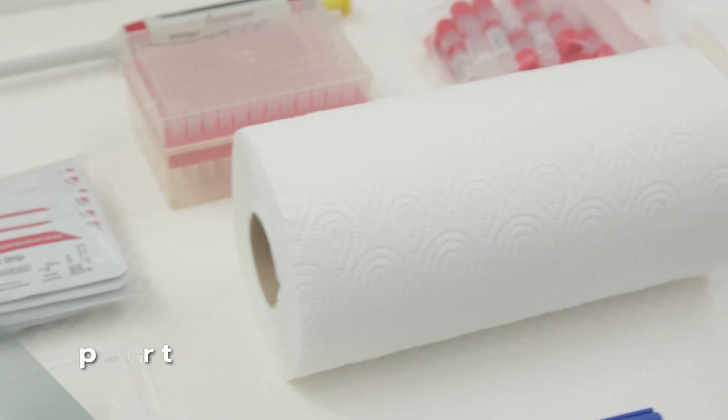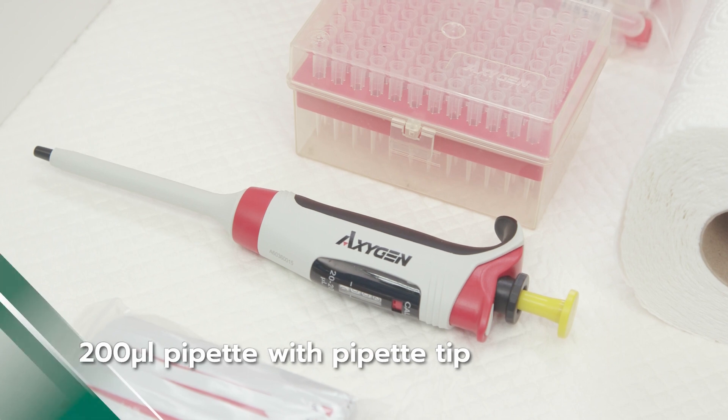Additional equipment also includes Infectious Waste Bags or Biohazard Bags, blotting paper, paper towel, and a 200 microliter pipette with pipette tips.